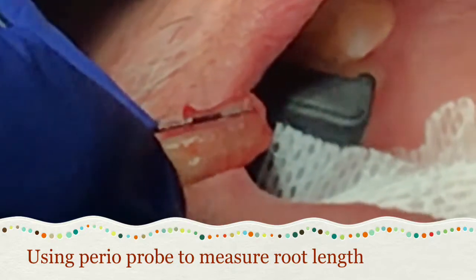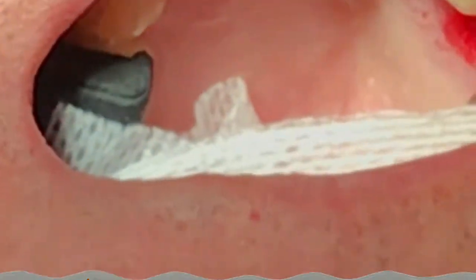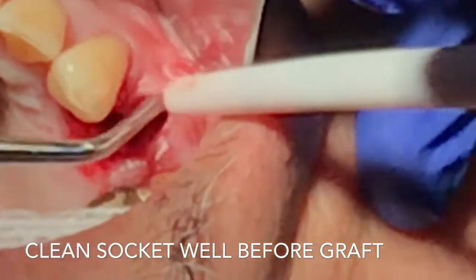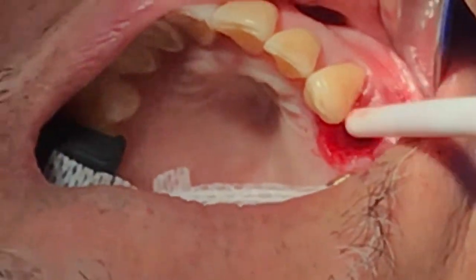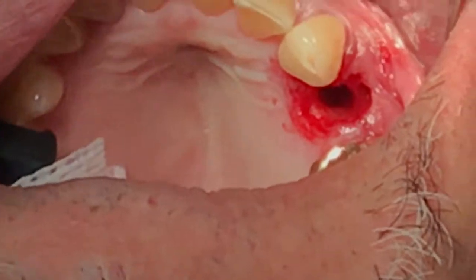It looks like the patient has at least nine millimeters of root. That means I can put in a nine-millimeter implant, or at minimum a seven-millimeter implant for next time.